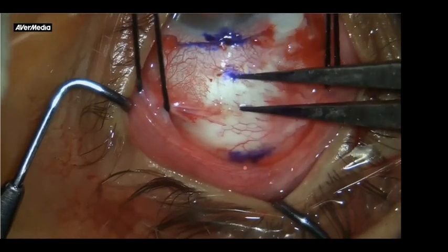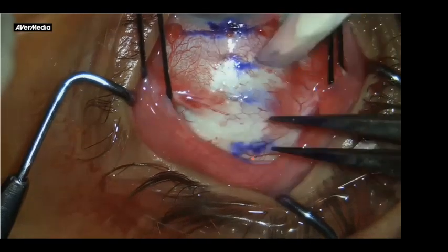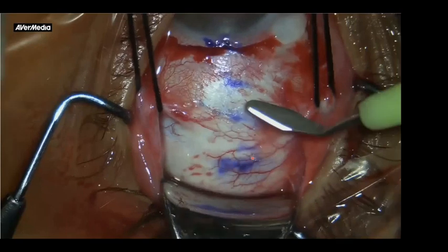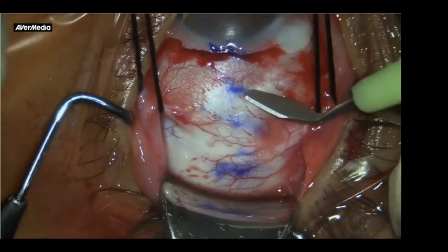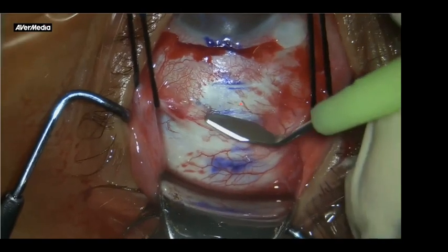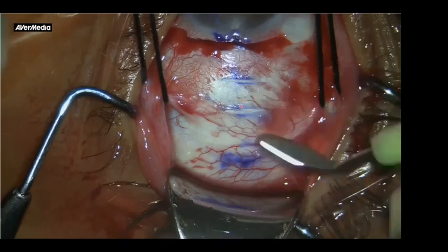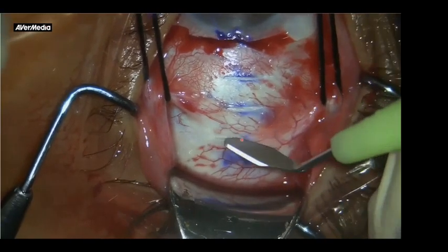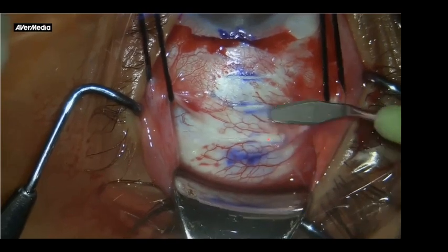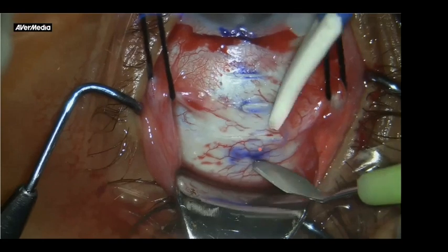Then I'm dividing into 3 millimeter tunnels, as all of you see, just a landmark. And then I'm going to use the crescent. Again, I try to use the crescent gently, because if the crescent is very sharp, it can go inside the eye. So I dissect those incisions. And then sometimes we can find remnants of episcleral tissues. You can take those away with the knife.